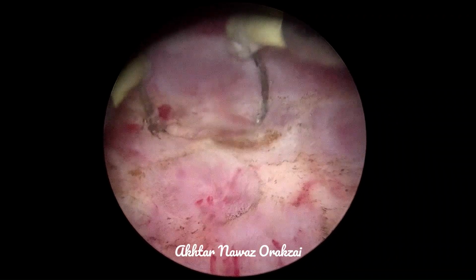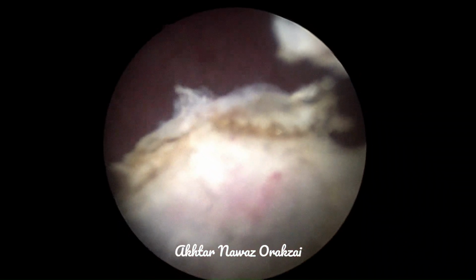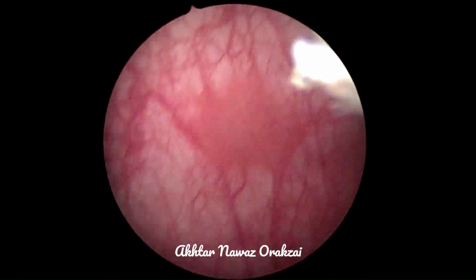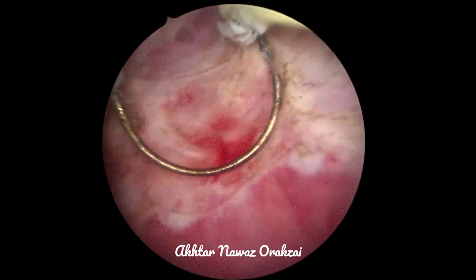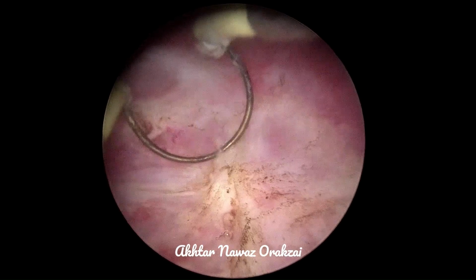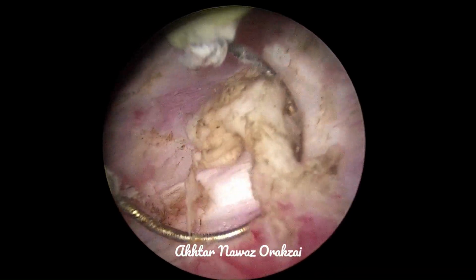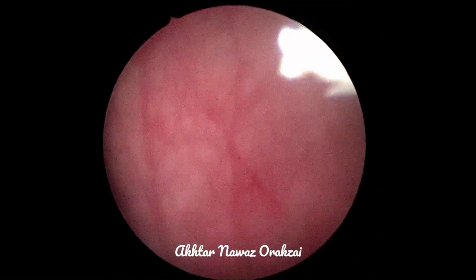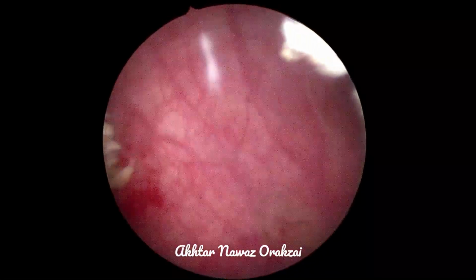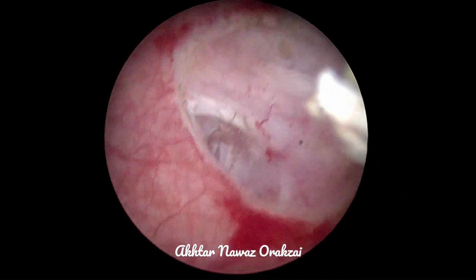So there are no areas of bleed. Here you can see that we are going deeper and we are removing this deeper tissue as we go for resection. Another small papillary mass has been identified, which will be resected later on once we take the muscle for sample. So muscle has been taken from two areas.